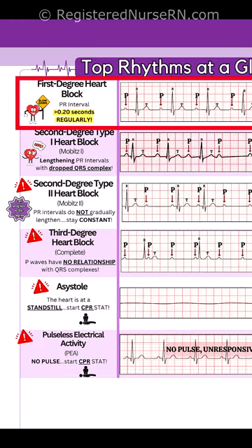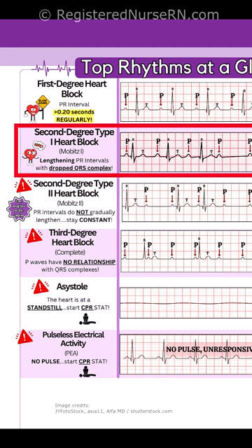First degree heart block: the PR interval is greater than 0.20 seconds regularly. Second degree type 1 heart block: there's lengthening PR intervals with dropped QRS complexes.